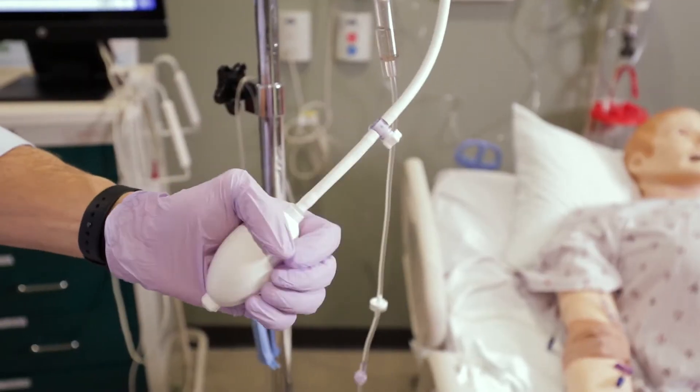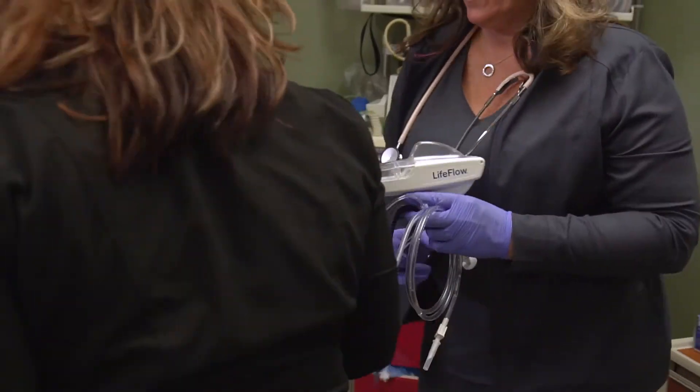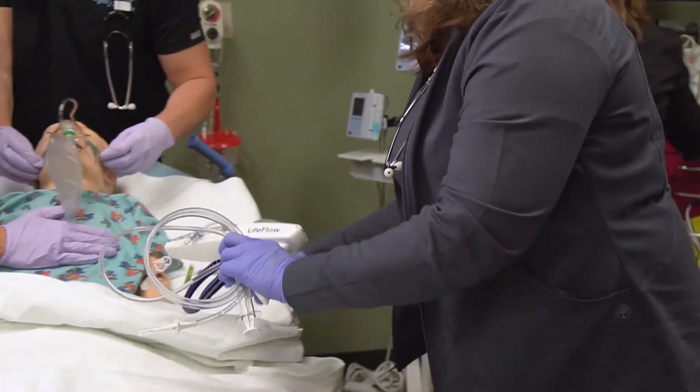I've taught a variety of different methods, whether that's pressure bags or a type of pump. We've done push-pull as well. Having the Life Flow to quickly infuse accurate fluid is so, so important.